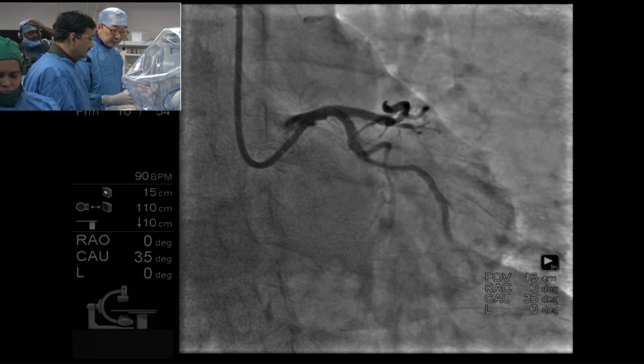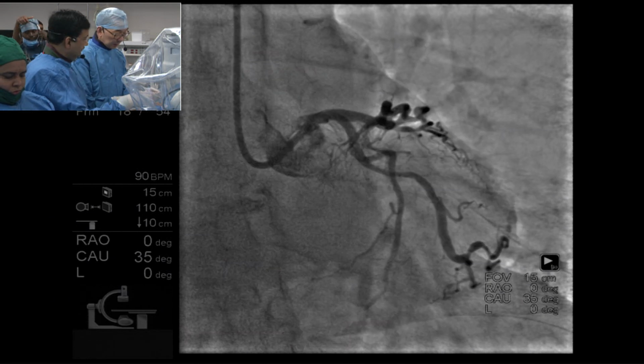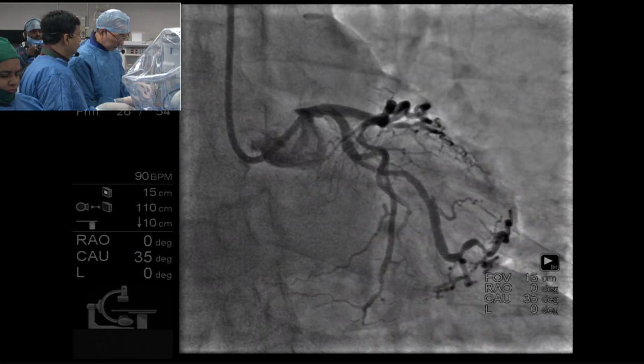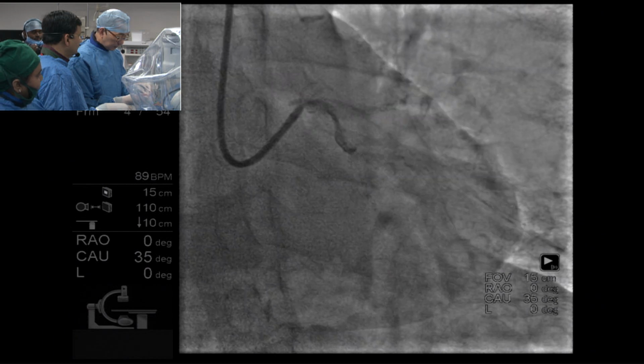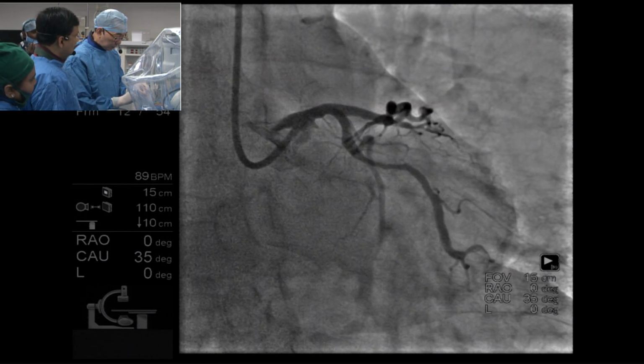Agree or not agree? That's a great strategy. I think the IVUS will be very important. It will tell you the degree of calcification. It will tell you whether it's napkin-ring calcification and whether you need modification therapy such as rotablation. So I think IVUS in this sort of situation is a must.